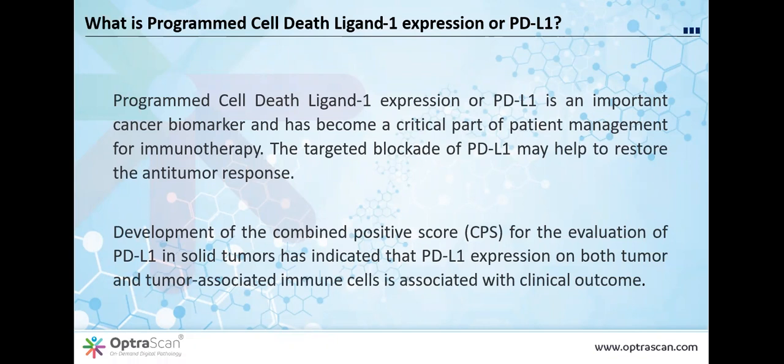For us as pathologists, the challenge is that it means there are 5 or 6 or 7 different tests that we have to evaluate, and these tests are not interchangeable amongst the different drugs, the different vendors, and the different platforms. So we have to learn to read all of these. It's become an incredibly important cancer biomarker and is a huge challenge for pathology because we not only have to set up the tests, we have to learn to read them, and we have to do it efficiently. We can't afford to spend an hour reading each individual slide, but these slides are extremely complicated.